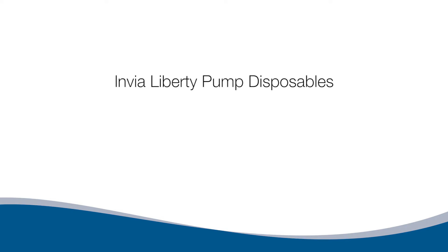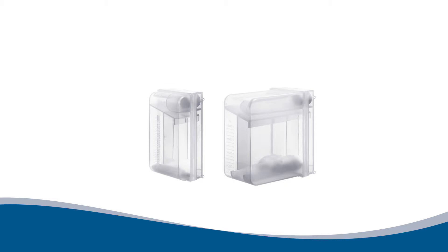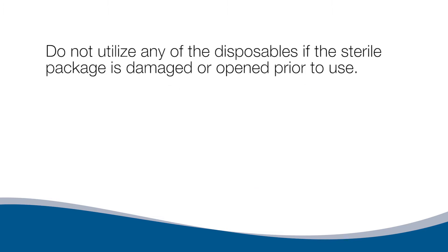Invia Liberty Pump Disposables. The disposable components include pump tubing with a quick connector consisting of 2 lumens. The large lumen is the suction tubing that removes exudate, and the second smaller lumen regulates the pressure. 300 or 800 milliliter canisters are available. Both canisters have a graduation scale to monitor and record exudate, an overflow protection/bacteria filter that prevents contamination of the pump, and a sealing cap to assist with disposal. Do not use any disposables if the sterile package is damaged or opened prior to use.